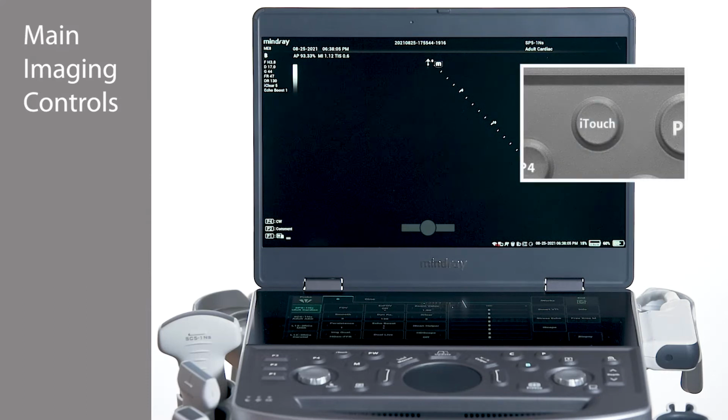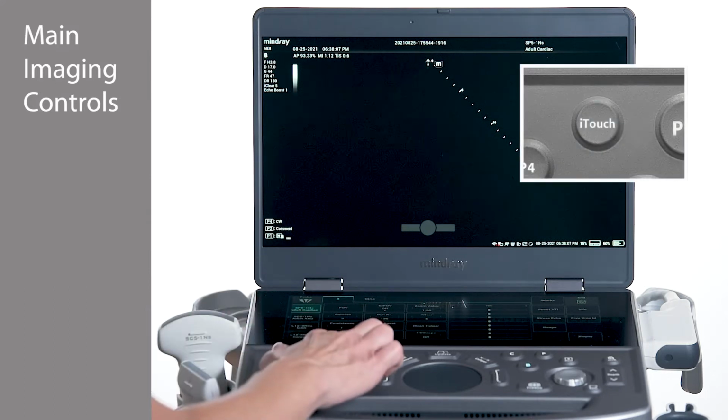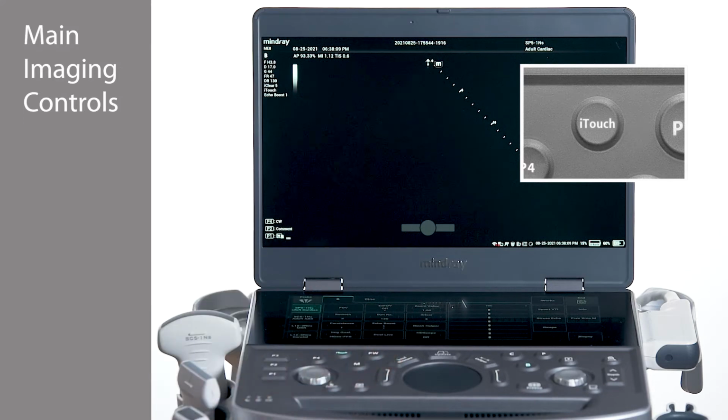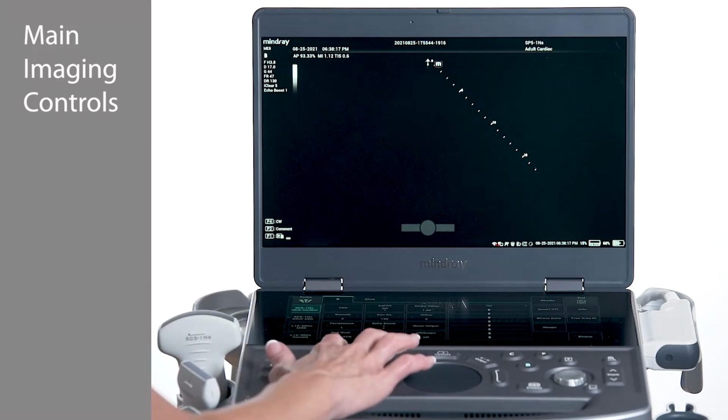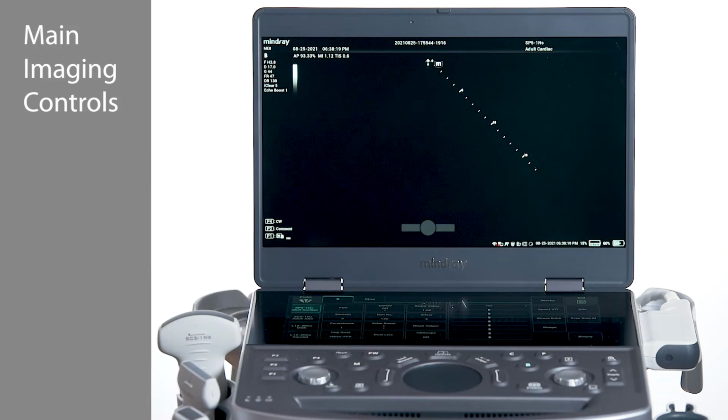On the left side of the control panel is the iTouch key. This is the auto gain optimization. Once it is pressed, the key will stay highlighted. To turn it off, press and hold the iTouch key. iTouch can be used in both B mode and pulse wave mode.